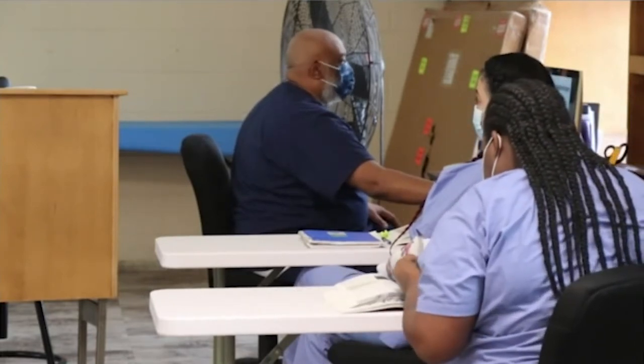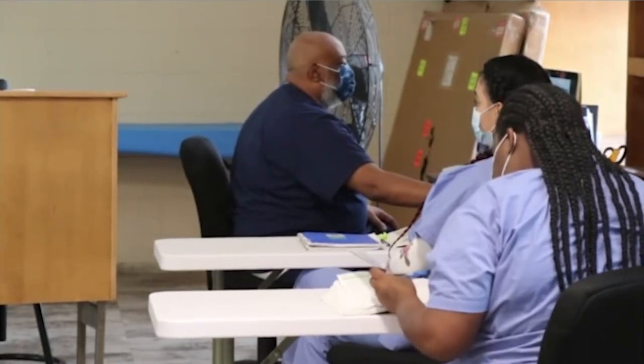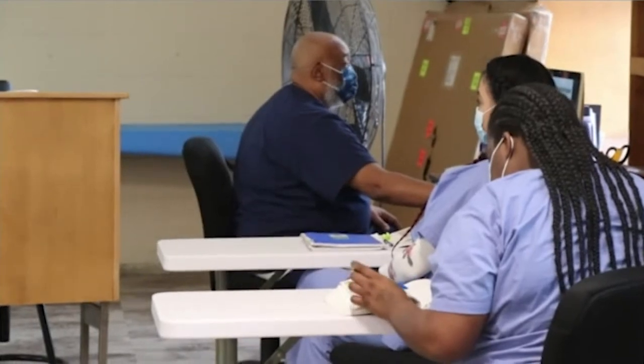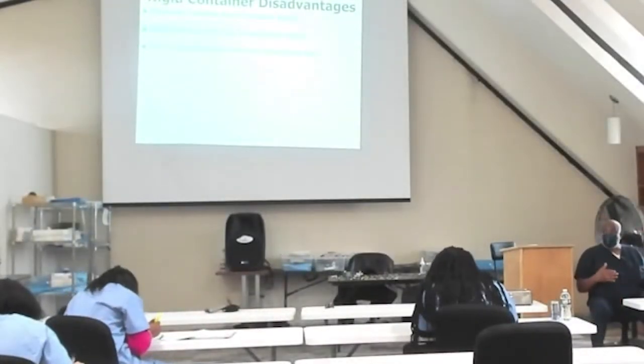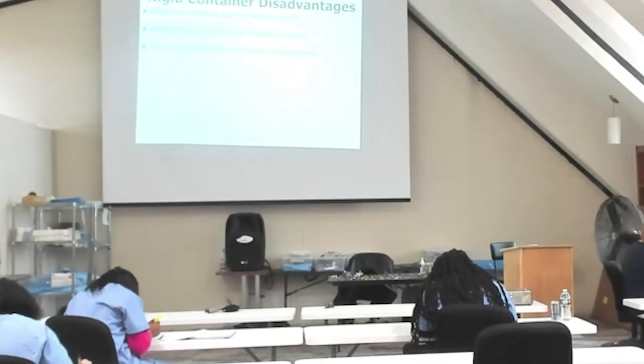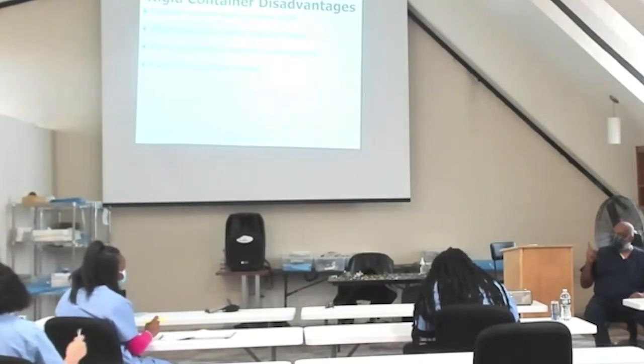Okay, one of the other things, some concerns, because there's a good and bad to everything. The disadvantages to using rigid containers are the weight, because you may be a shorter person, right? And you have to lift them and carry them versus a taller person, or weight appropriate. So the concern over injury, balance and weight is something. Where it says additional time may be needed for drying, how will we know how long to dry something? IFU. What does IFU stand for? Where do we get them?